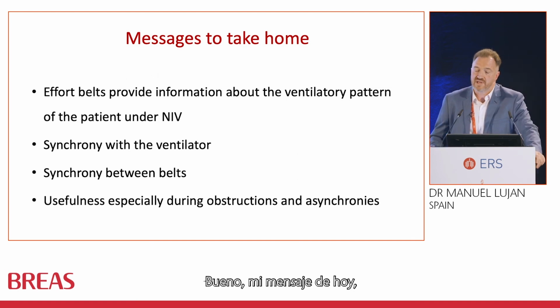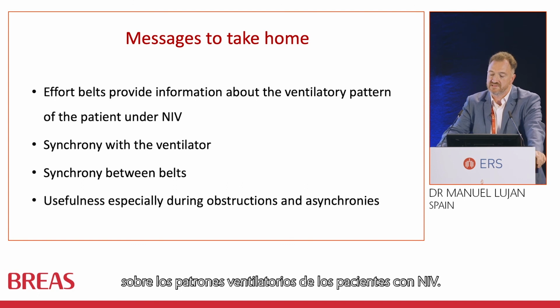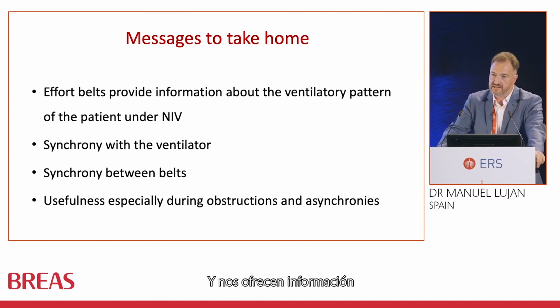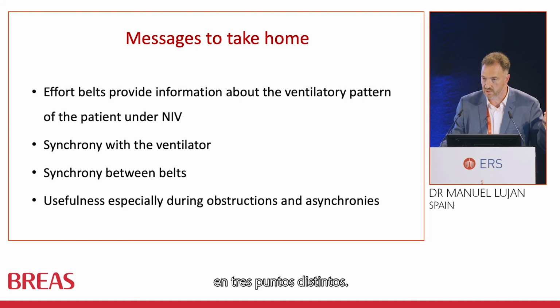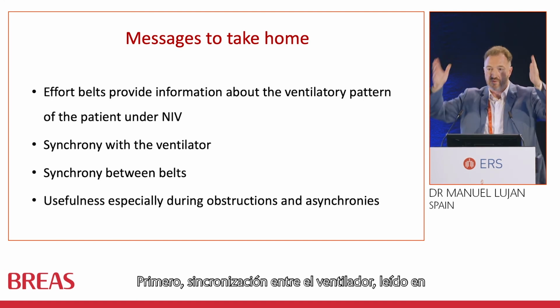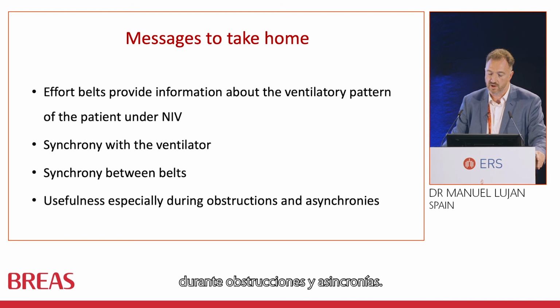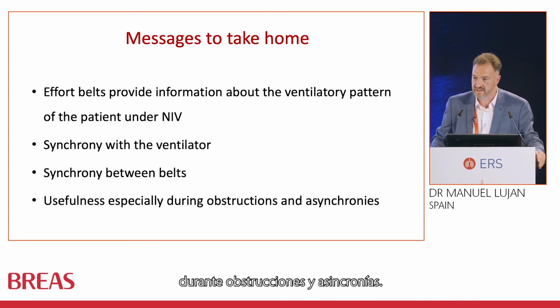Well, my take-home message: effort belts provide information about the ventilatory pattern of the patient under NIV, and we can get information at 3 different points. First, the synchrony with the ventilator, reading in vertical. Second, the synchrony between the belts. And third, the usefulness, especially during obstruction and asynchronies. Thank you very much.